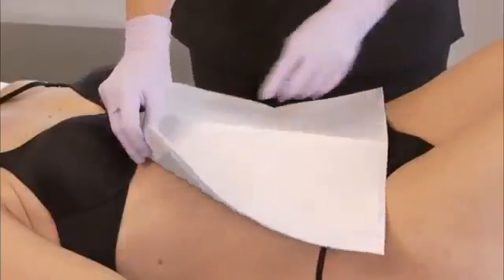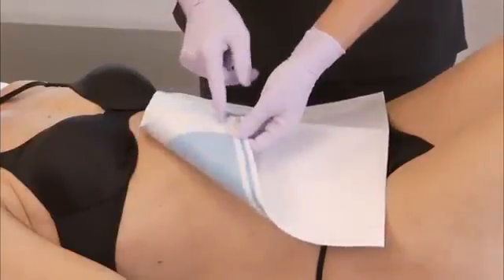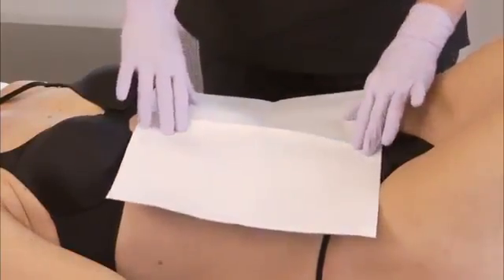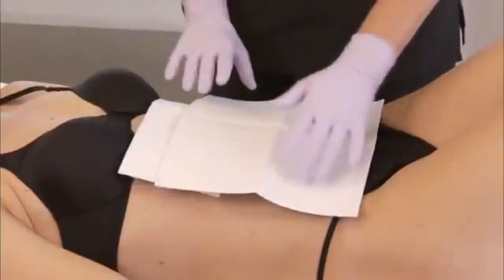When applying the HK pads over the surgical area, all of the incisions must be covered, taking care not to place the plastic borders of the pad over any incisions. If needed, you can overlap multiple pads so that the entire area is covered, but you do not want to cut your HK pad. Cutting the pad will result in a non-sealed side.